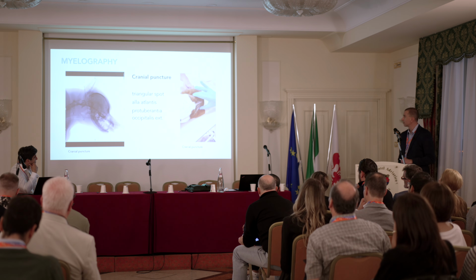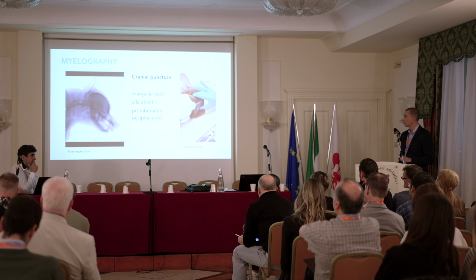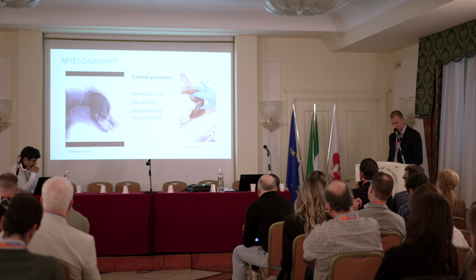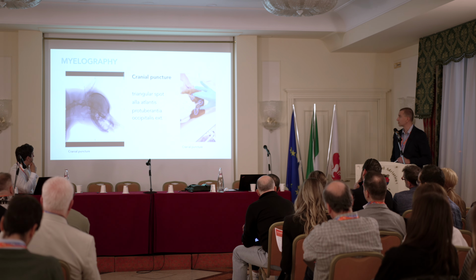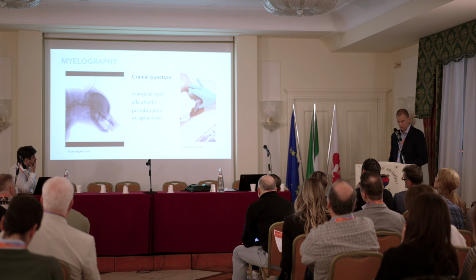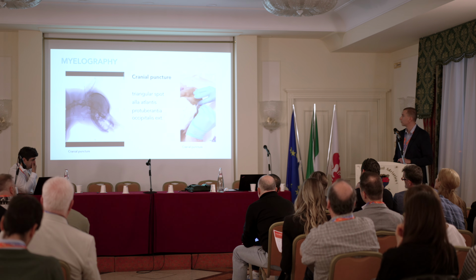Yeah, so there are some perspectives from the gantry, inside and outside, how to see how we are performing this. Cranial puncture, the same. We are using some anatomical landmarks. So on cranial puncture, we use Ala Atlantis at the anatomical landmark here. External protuberance occipitalis externa here. So those three landmarks can navigate us. And if we do that, the puncture is not a big problem to go in.